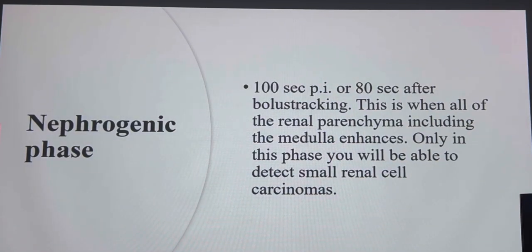Arterial phase: contrast in the arteries only, minimal contrast in the portal vein. Early venous phase or late arterial phase: you can see vanishing contrast from the arteries, but maximum contrast in the portal vein. Late portal or venous phase: you can see maximal contrast in the hepatic veins, less in the portal vein, and markedly less in the arteries. Okay? You will remember this when you review it.